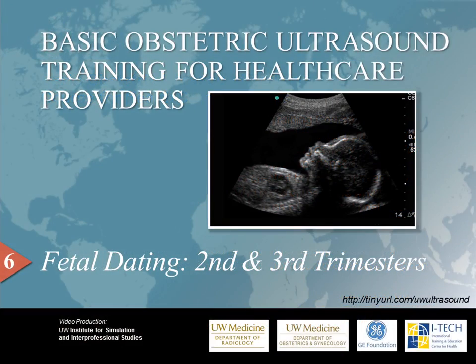My name is Dr. Christina Adams Waldorf, and I will be narrating the 6th video in our Pregnancy Ultrasound series. This video will teach how to determine the gestational age of a fetus in the 2nd and 3rd trimesters. Please visit our website for access to all of our video and training materials.